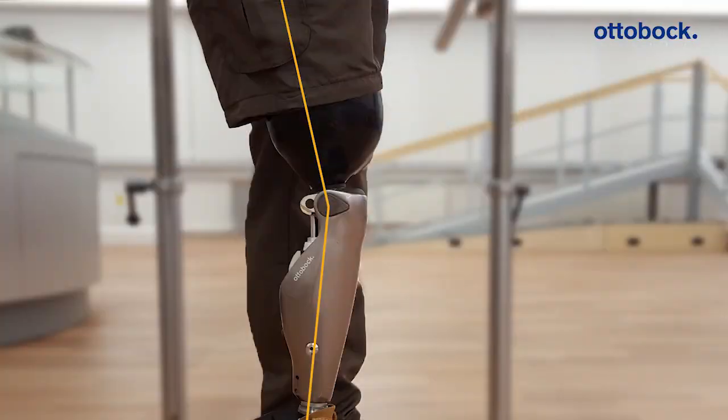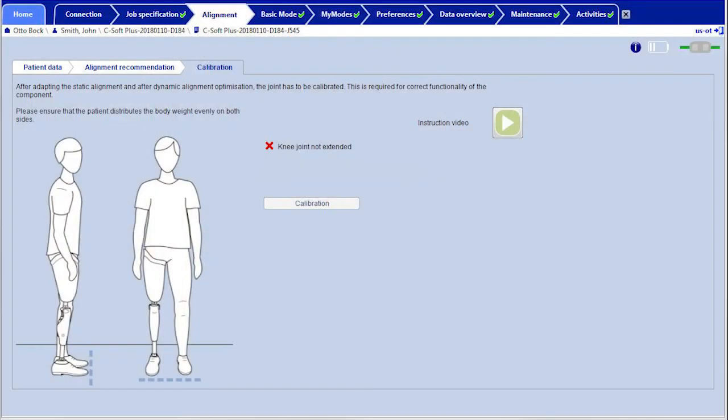If the knee joint is not fully extended during the calibration, a message appears in the software as well. If the knee joint is not extended while standing, this could indicate that the alignment is less than optimal.